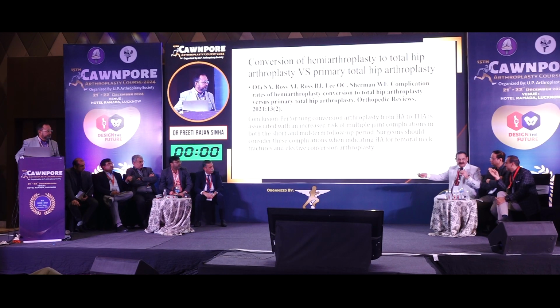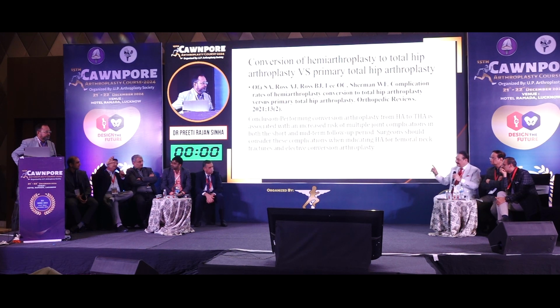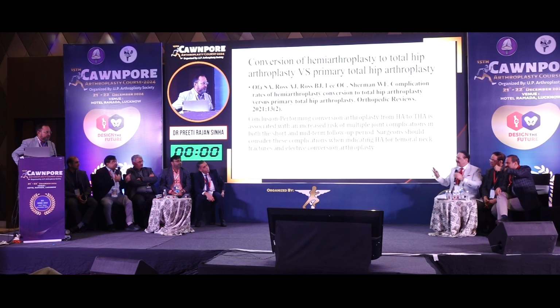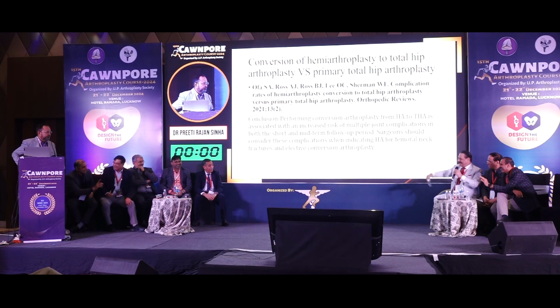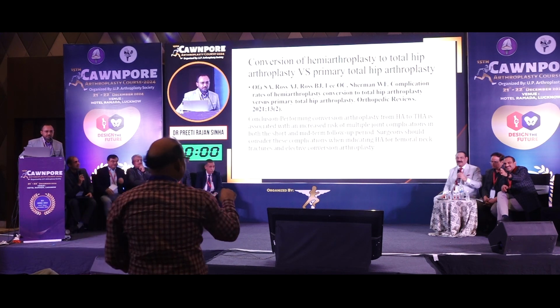This is what I say. Till now, I've never seen bone grow between the two holes in an Austin Moore. It is always fibrous tissue, and strong fibrous tissue, so the implant will rotate but it will not come out. So that's the message. Strong fibrous tissue needs something sharp to cut it, going anteriorly as well as posteriorly, with a sharp osteotome. That is in some cases, not all cases. The worst case scenario is if somebody has cemented an Austin Moore. Then you need Dr. Chatterjee to take it out. Not everybody can take it out.